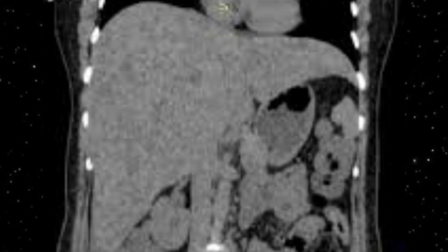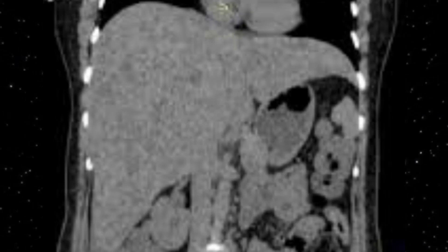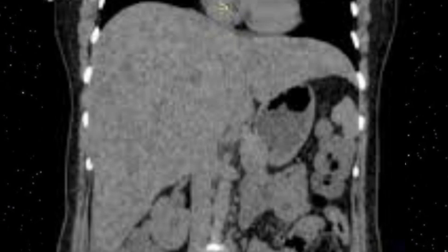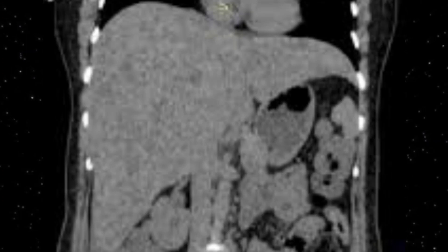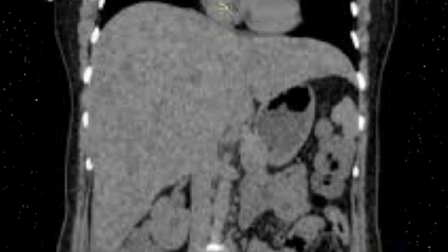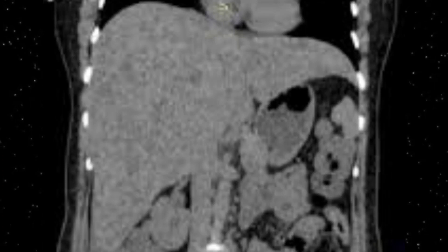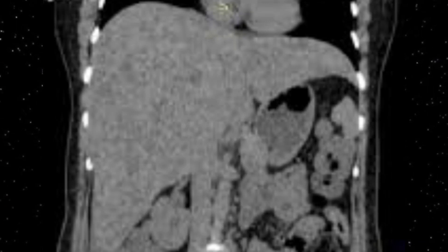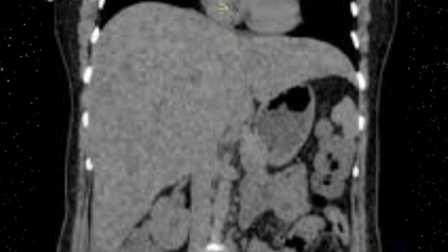On this coronal CT image, the liver appears slightly enlarged. Both right and left lobes are clearly visible, along with kidneys and spleen. The liver parenchyma is interrupted by multiple tiny hypodense lesions — these are biliary hamartoma. This is a particular pattern you can appreciate immediately whether on ultrasound or CT abdomen, in coronal or axial views, and should not be missed.